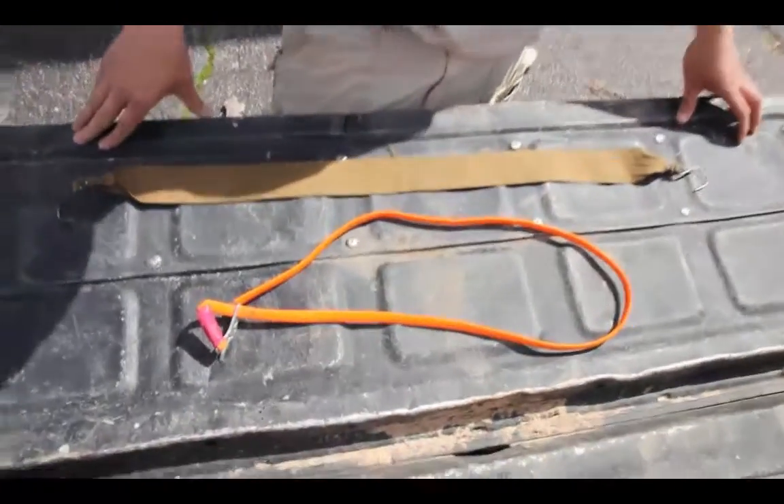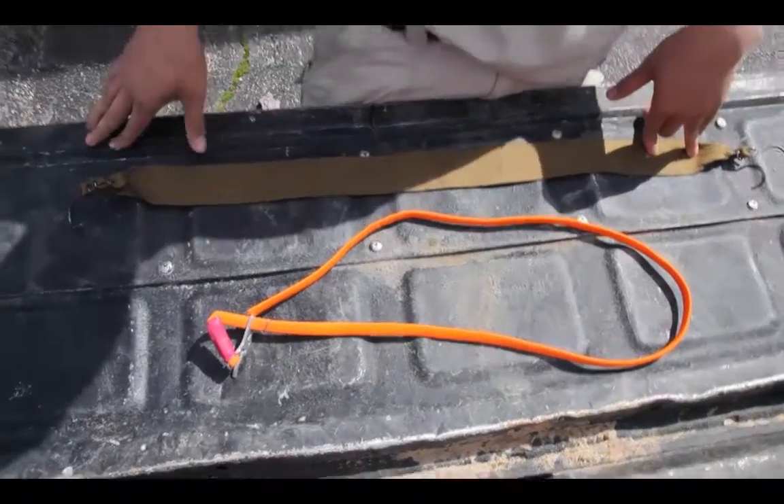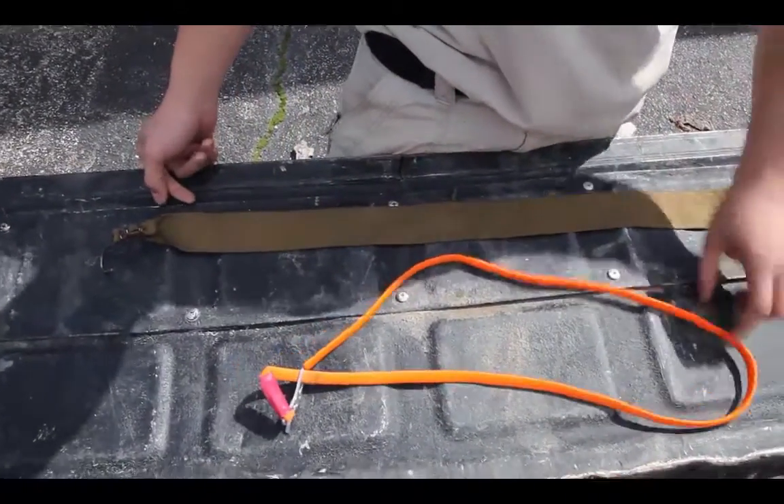Hey guys, welcome back. Today I'm going to talk about tourniquet usage. These are two basic tourniquets you've probably seen before that I carry with me — a TK4 tourniquet by H&H and a RATS tourniquet.